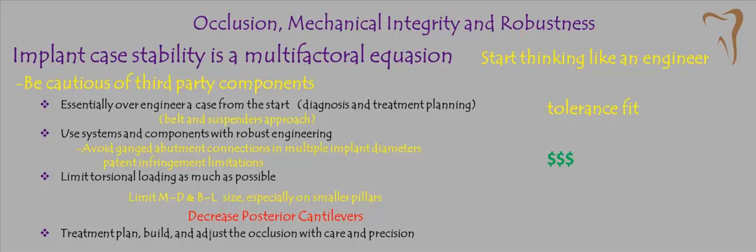And for crying out loud, don't put cement and other things into the screws and the abutments. I've run into that as well, and nightmare situations. But anyway, limit torsional loading as much as possible. I think I've shown that in the cases that I've had. If there was one take-home message today, that would probably be it.